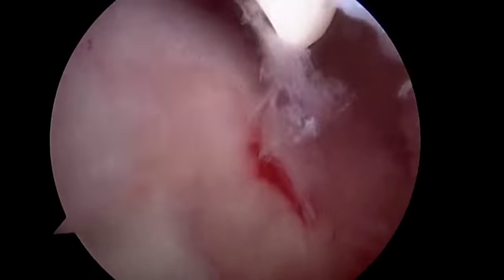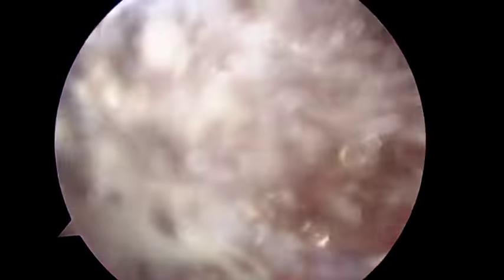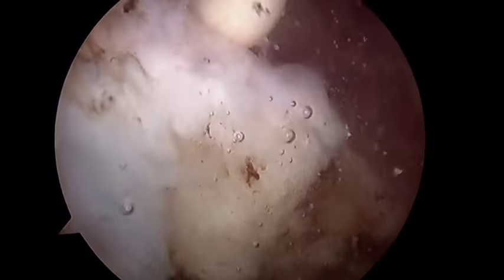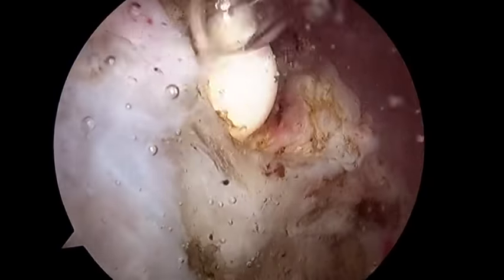So here's the rotator cuff here. And above us is the acromion and the AC joint, which we're going to take a look at. AC stands for acromioclavicular. So we're going to clean some of this soft tissue up, try to control some of the bleeding, because again, a sore, painful shoulder tends to bleed quite a bit. So we're going to take down some of this soft tissue.